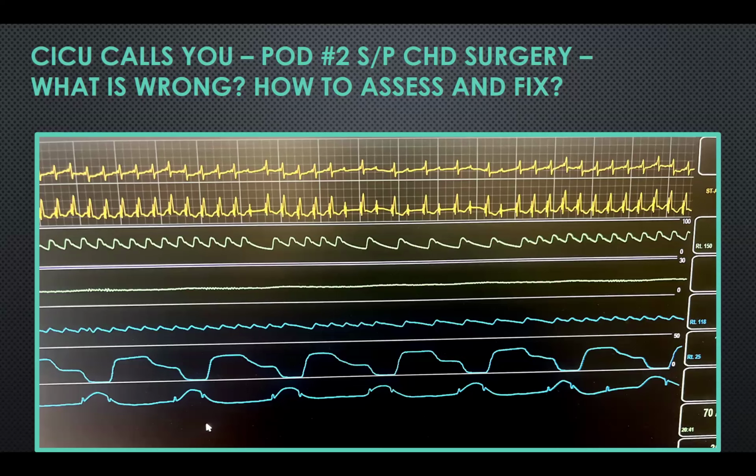So, why, Vlad, are the thresholds not great in these leads? Like if I put in a permanent pacemaker, and I screw it in, I'm going to have a pretty good, low threshold, and I can confidently say if it's good in the cath lab that it's going to likely stay that way for a long time. Why is that not true with these?